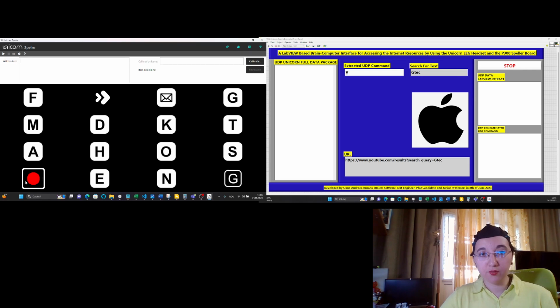And in the last row, we can observe some graphical representations for abbreviated forms of famous companies such as Apple, Emotiv, Neurosky, and g.tec. The last three, Emotiv, Neurosky, and g.tec, are famous brain-computer interface companies. Here we can see that the EEG raw signal has a good quality. So we can start our application.